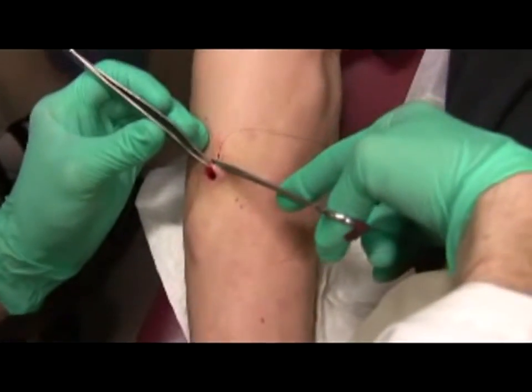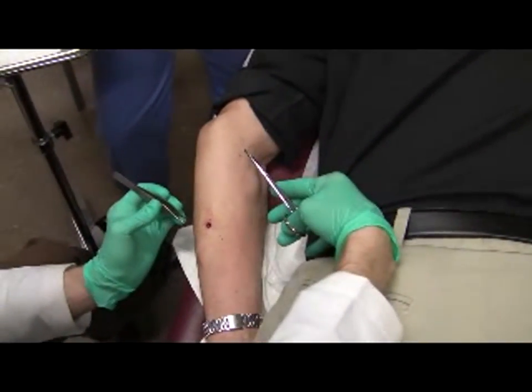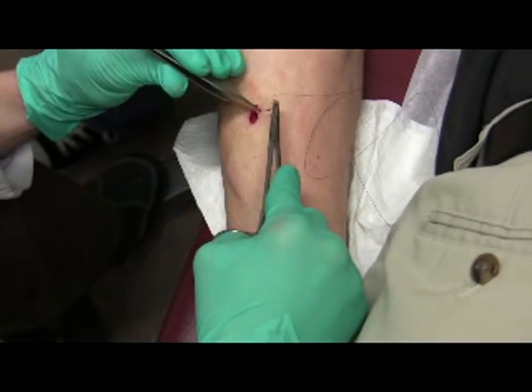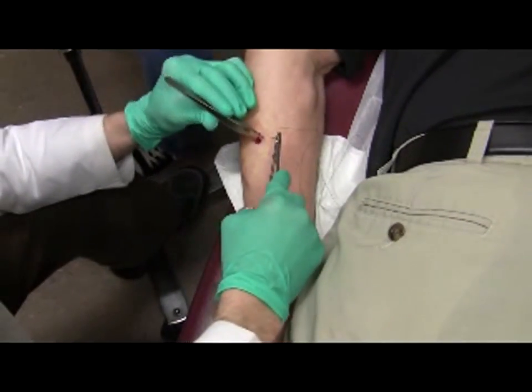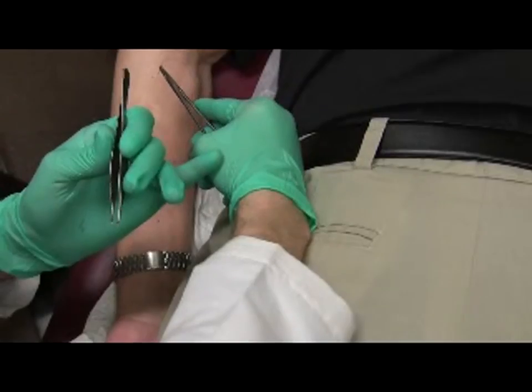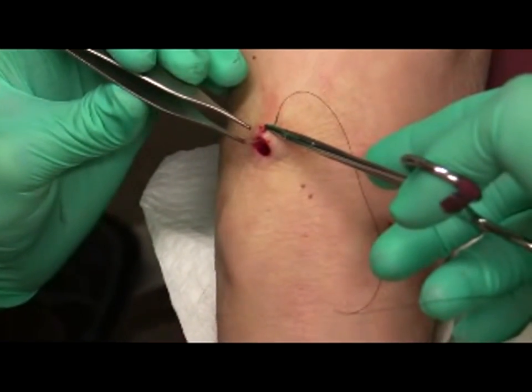Rest your right fourth finger on the skin while pressing the needle through. My hand has to be somewhere touching the patient's body — I use the small muscles of my hand to push the needle through. If my hand is completely disconnected from the body, when I push and there's resistance it will fly forward too much with very little control. In this case it's an awkward position, so I'm putting my wrist on his body as the resistance point. This way, once the skin gives under the pressure of the needle, the needle does not penetrate beyond the skin out of control.